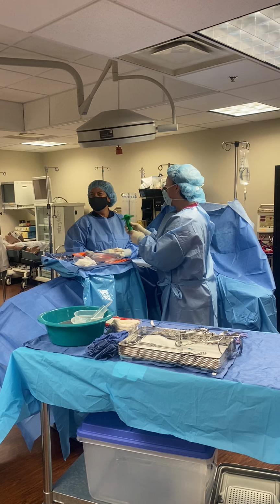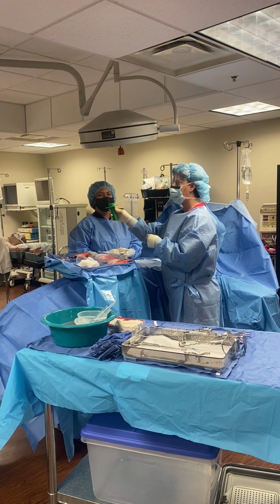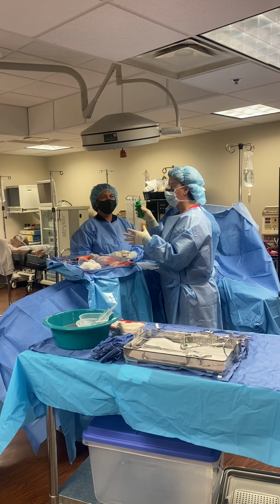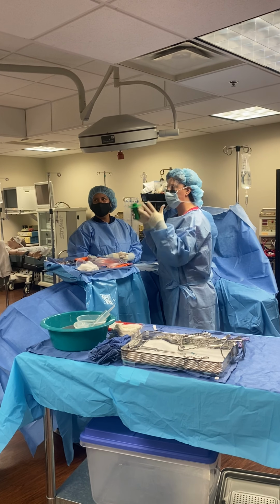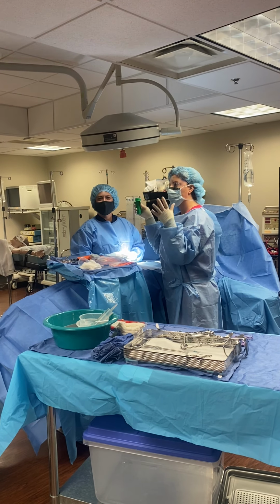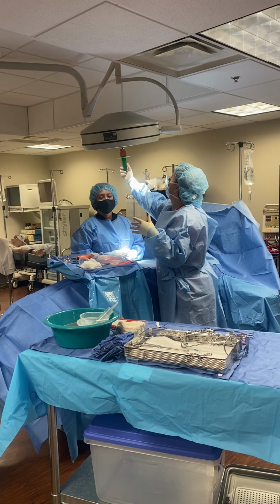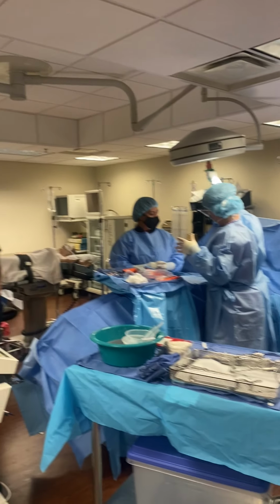So the light handle, this kind just screws into there. This little thing is to protect your hand because it's not sterile up there. I always think of putting on the light handle as a two-part job. One, you put it on, and two, you focus it to your site because we're reaching up out of our zone, right? So we don't want to do that any more than we have to. So we're going to put it on and then adjust it to our field. Watch our surgeon's head.